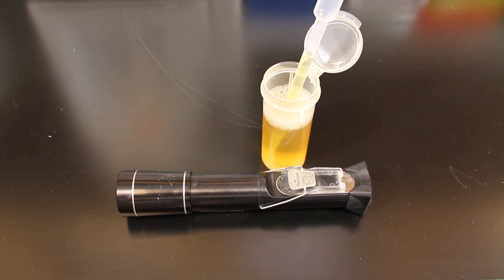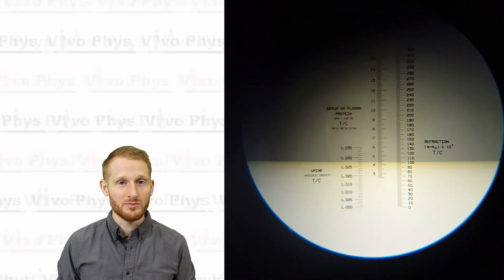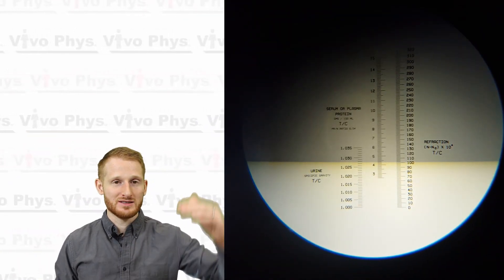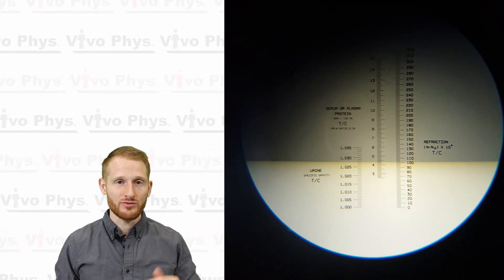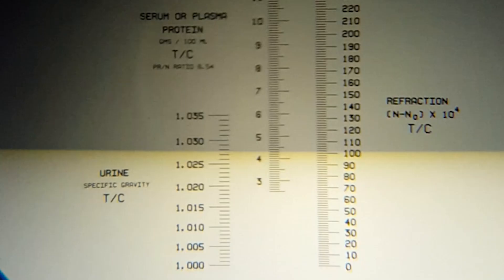Once that happens, you can take the refractometer, hold it up to your eye like it's sort of a telescope, and just walk underneath some sort of bright overhead light. Make sure that you are under a light because it's going to use that light to shine through the liquid, so it's easy for you to see what the specific gravity is.